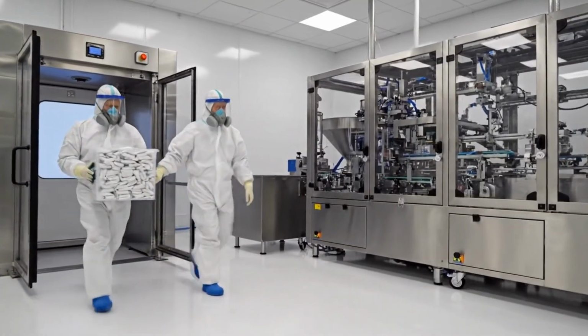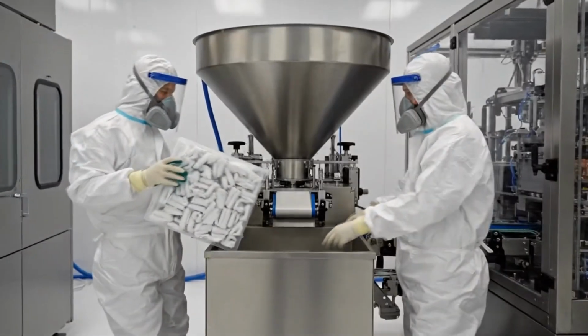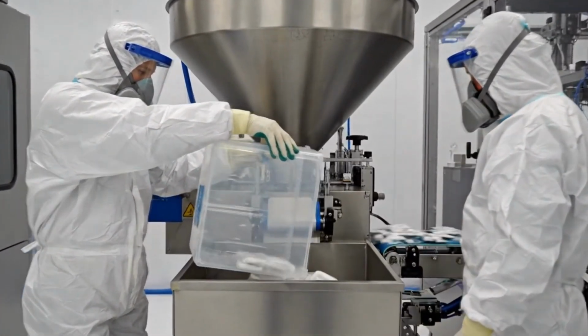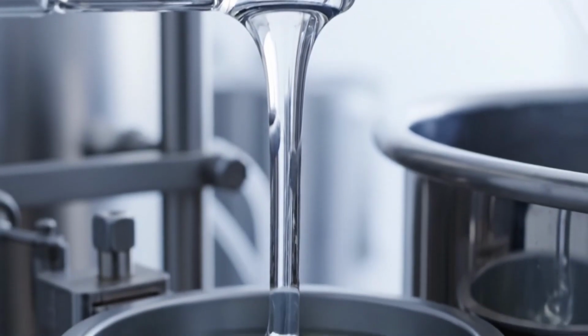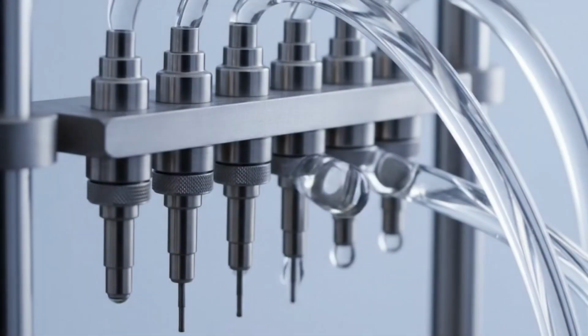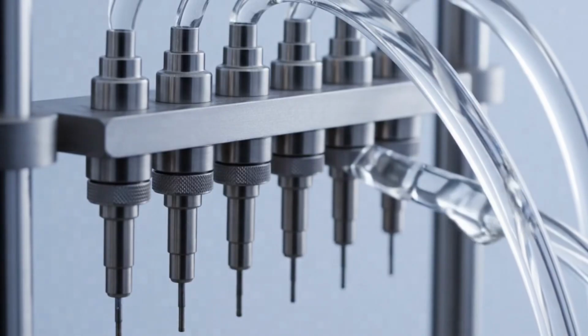To ensure medical-grade safety, the final packaging happens in an environment cleaner than a hospital operating room. Silicone lubricant is the industry standard. It is non-reactive, long-lasting, and 100% skin-safe.